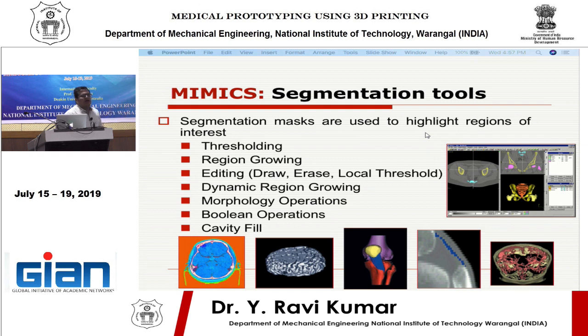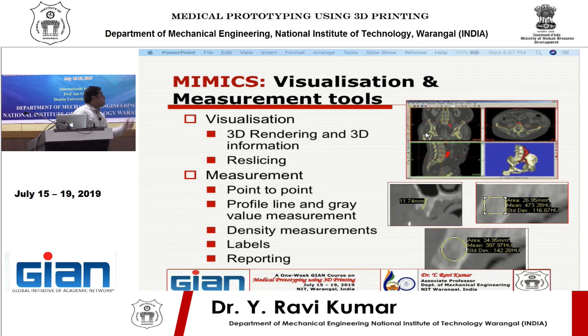These are the base or core tools which you have in Mimics, or not only Mimics. Any medical image processing software must have these basic tools. So to start with, images, editing of the images, or giving different thresholding or different Hounsfield numbers in order to separate them and finally getting a region of interest. And then sometimes we need to reslice it, or sometimes we need to render it. So you have some neurovascular kind of stuff, and cardiac wants to know. So you have plenty of stuff to do in it. Any medical image processing software I'm talking about.